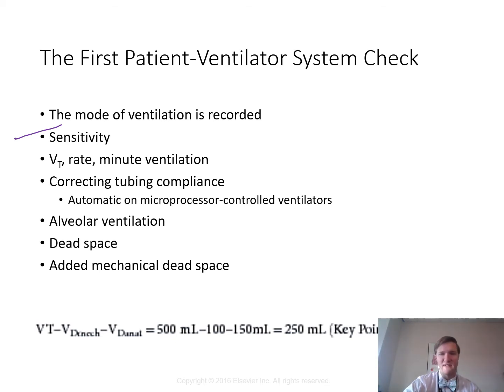All right, so let's look at tidal volume, rate, and minute ventilation, which is this next bullet point here. Tidal volume, frequency, and minute ventilation are typically displayed digitally on the front panel of the ventilator. So you're going to have some way that the ventilator will display that. Now, different ones have their screen set up differently, but most ventilators will display these. The set tidal volume, especially for volume targeted ventilation, and then they'll have something like exhaled tidal volume as well, right? So they'll give you not only what's being delivered, but what the patient's exhaling. So these microprocessor controlled ventilators usually provide very reliable flow and pressure monitoring. So that's one of the good things that we can do there.